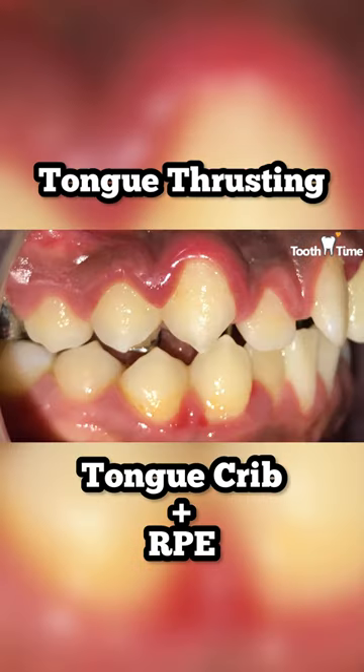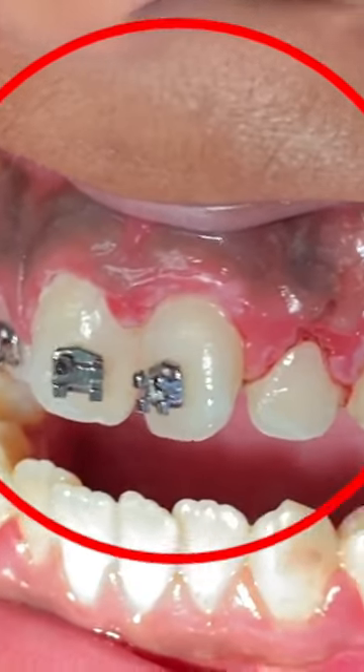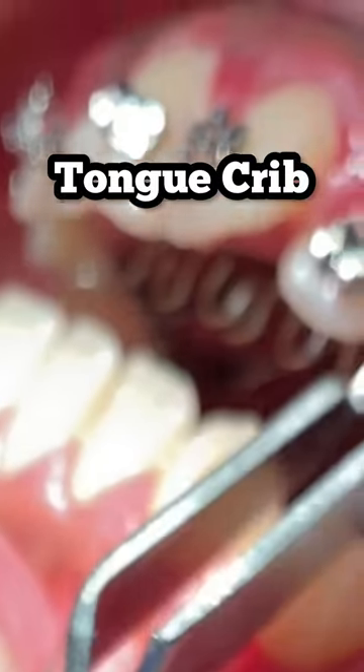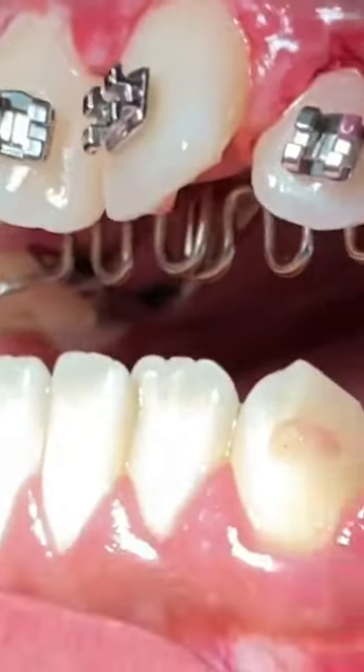Hey everyone, this is Abby, your hygienist here at Tooth Time Family Dentistry. This is a case that we worked on in the past. He started off with what we call an upper appliance with a tongue crib, because he would tongue thrust his tongue a lot when he would swallow.